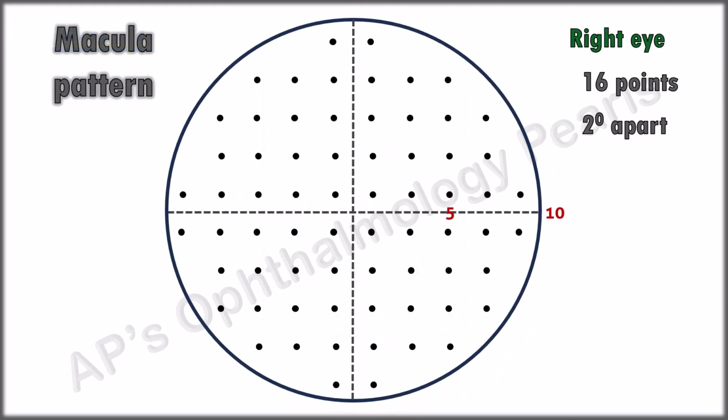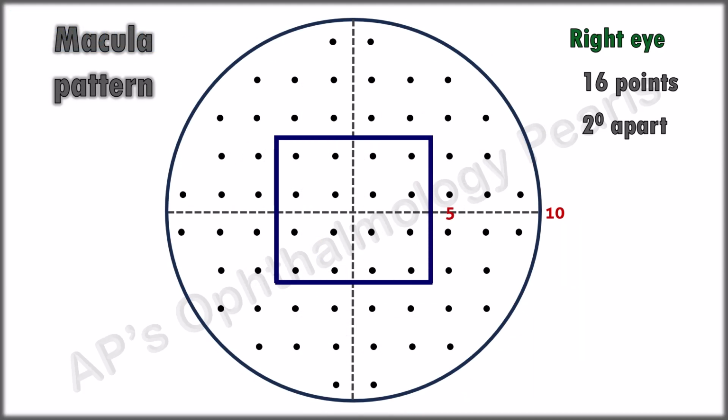The Macular Program tests the central 16 points of the 10-2 program and is most useful to determine if the macula is split. It is tested with a size 3 stimulus, and if the sensitivity is too low, a size 5 stimulus is used. Absence of split macula with a size 5 stimulus indicates a better prognosis. The Macular Program is generally used only when the central 5 degrees of field remains. Each point is tested twice and the second value is depicted as a second numeral in brackets below the points tested.